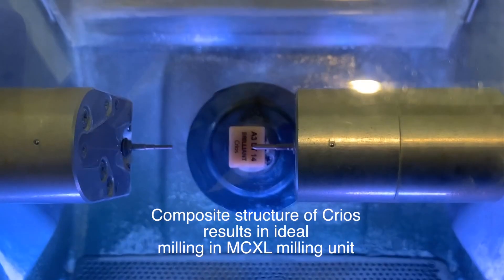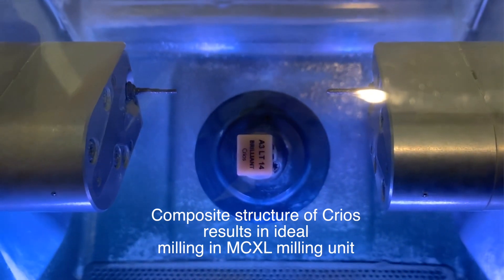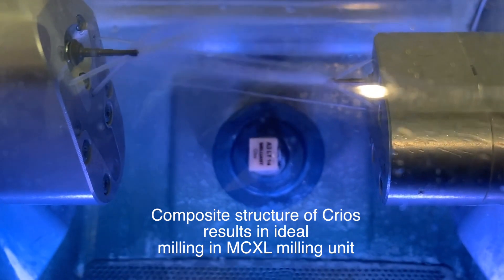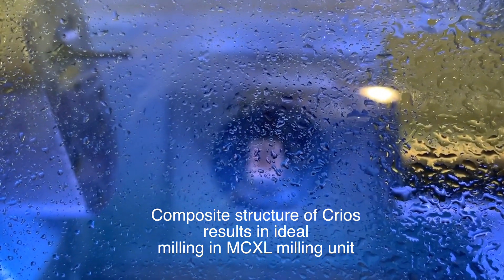Because the material is a composite, the diamond burrs grind the material accurately in the CEREC milling chamber for a precise fit. Due to its composite structure, the material can be repaired using similar techniques for repairing traditional composites.